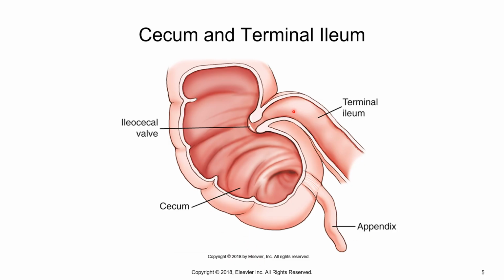As we said in the lecture on the small bowel study, a small bowel study is deemed complete when barium passes through the ileocecal valve, and then they take a spot image of that valve for proof.